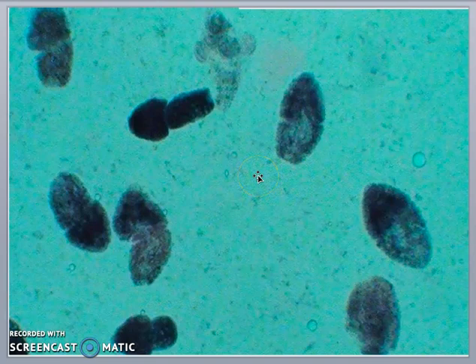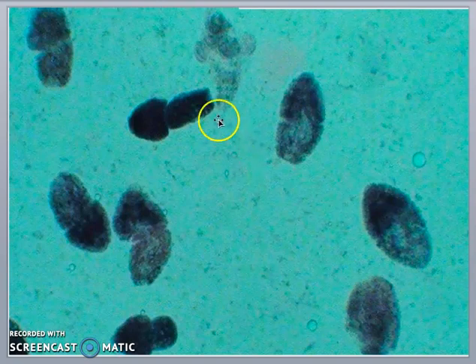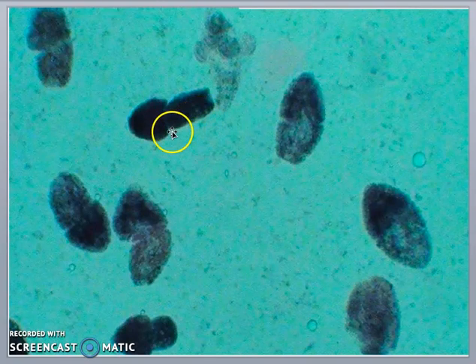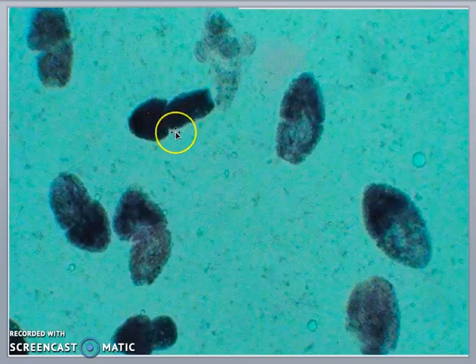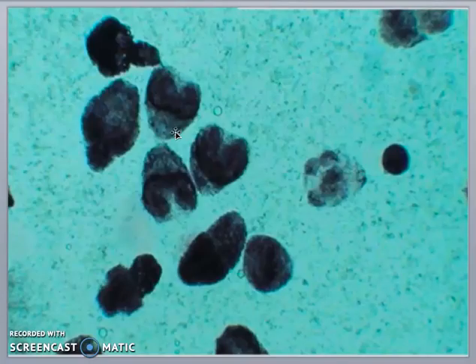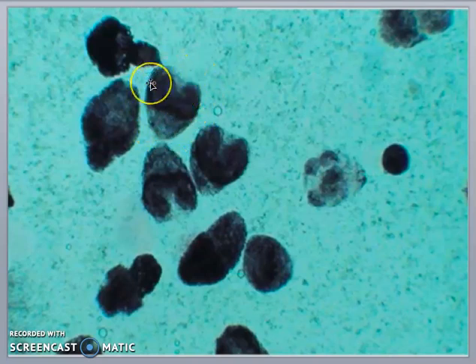The cystic fluid collected from the hydatid cyst is centrifuged, and the centrifuge deposit is examined under light microscopy. Light microscopy reveals both evaginated protoscolices and some invaginated protoscolices.